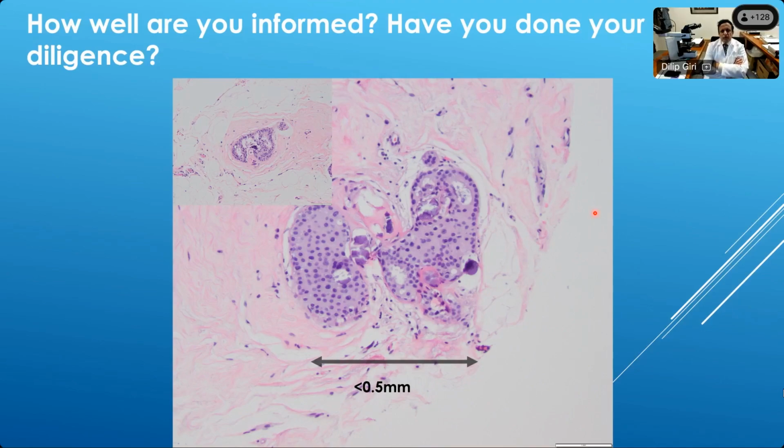My next step is to actually look at deeper levels of the tissue, because sometimes, when a tissue plane is only superficially cut, you may only get part of the picture. As you go deeper into the block, much more may pan out, and your diagnosis will then be more accurate than it would be when you are looking only at one portrait on the slide, right? So I think this is something which is not emphasized enough and should never be overlooked.